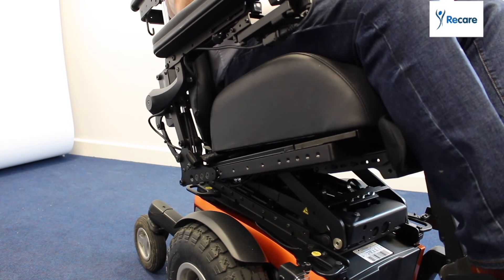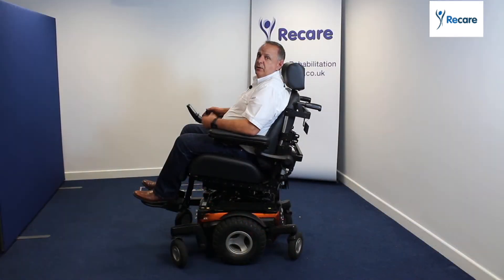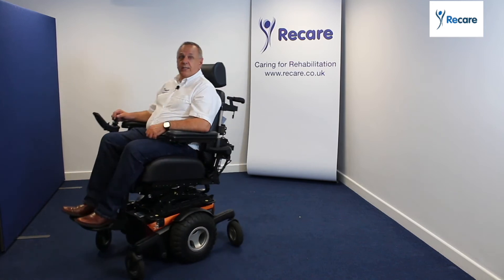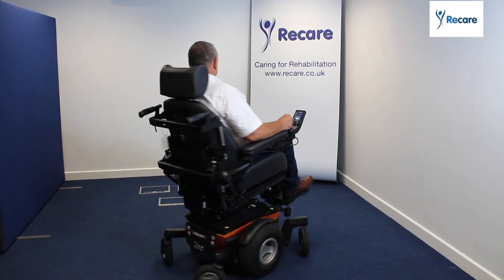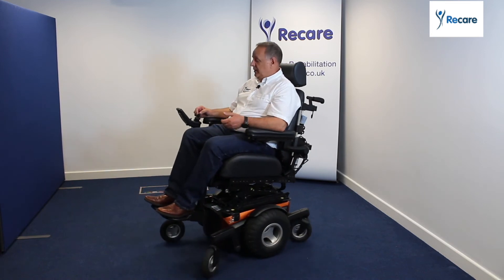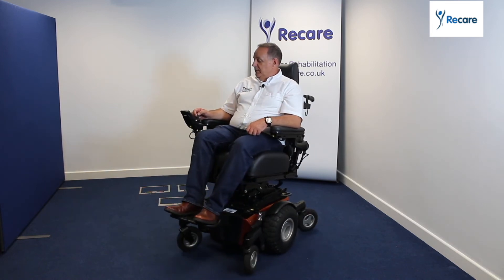So now you can see I'm in a good tilt position, and I'm still driving by the way, so that See Me Technology is still working. It's allowing me to — now I'm lifted, I'm tilted — so I'm in a really comfortable position. Clinically it's very good as well, because it allows you to sit in certain positions, so that allows me to do the tilt.